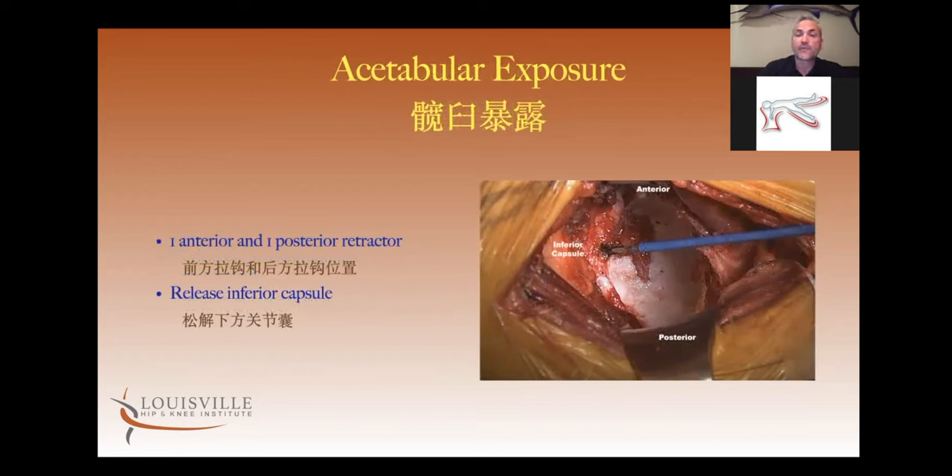On exposing the acetabulum, I use two retractors — one anterior, one posterior. You'll see an inferior capsule fold that stretches across the acetabulum when those two retractors are in. I take a bovie and make a longitudinal cut to release that inferior capsule, but I do not excise it because further down that gets into the posterior capsule — I don't want to cut my posterior capsule out. So I'll make a release in it but won't remove any.